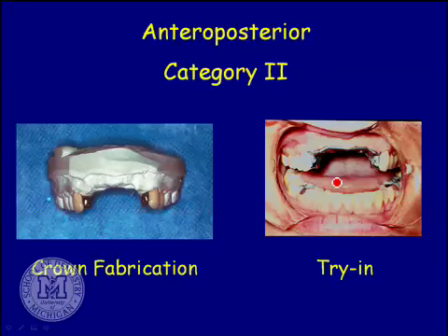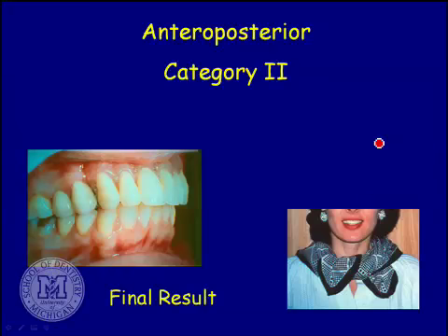So we go ahead and get things set up. Here's our framework. So this framework engages the mesial proximal of those teeth next to the edentulous area, and then it rocks posteriorly and seats over the posterior teeth. I apologize for the burnout on these. And the thing you see here is your replacement teeth, and what you've got here is no clasp. So you've got a situation in which you're not showing any clasp.